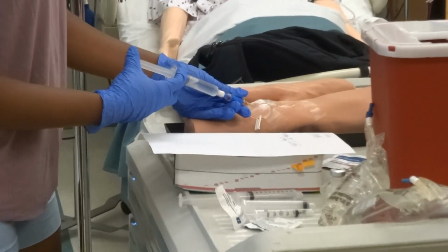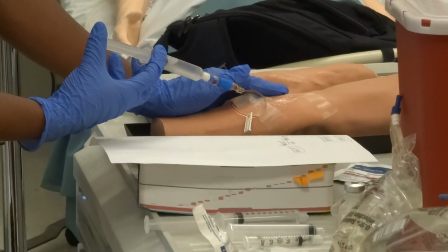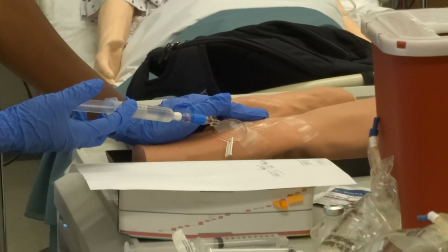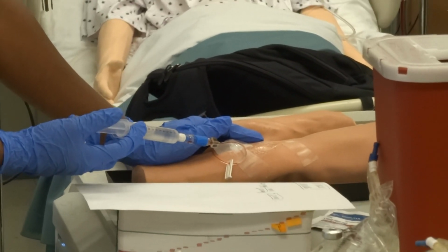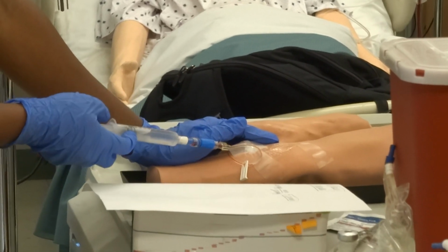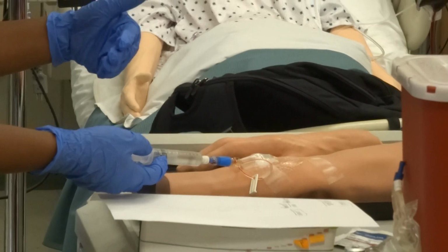Okay. So since I said 5 is okay for a peripheral line, what I can do is go ahead and check the patency. You don't have to push the full 5 to check because we know this patient has heart failure. They might be on what? Fluid restriction. Yeah, fluid restriction. So I'm giving this plus additional fluids potentially, then it's kind of like building up, and each time I come in and check, I'm doing that.